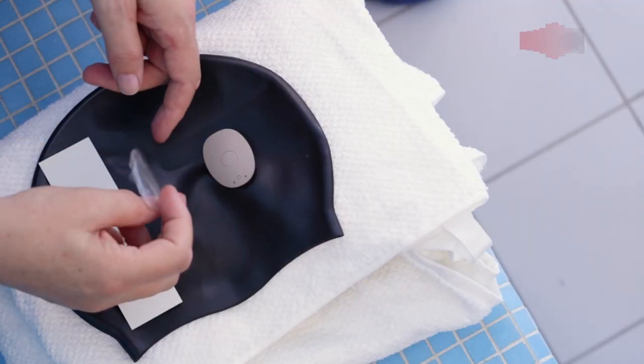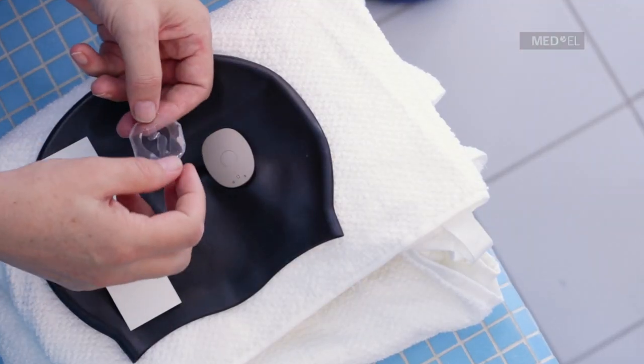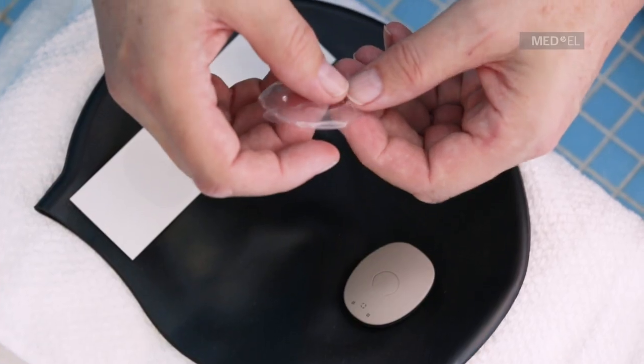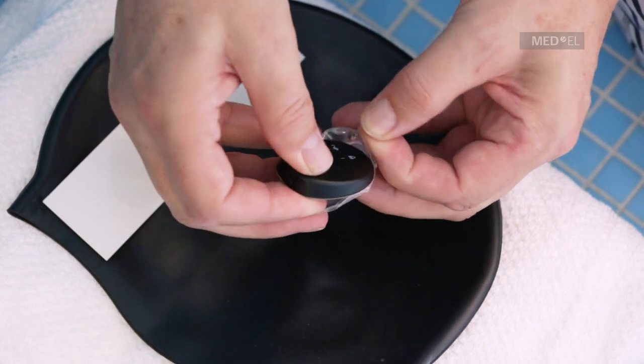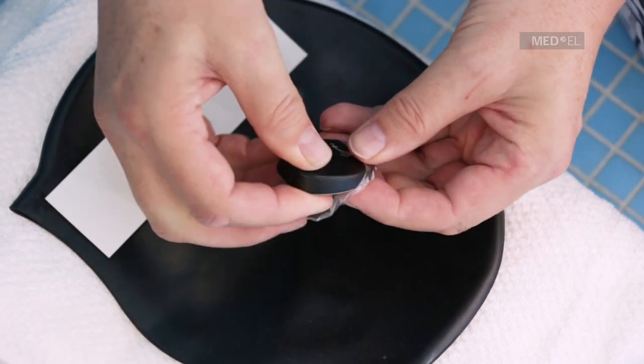Check that both your hands and the waterware cover are clean and dry. Hold RONDO 2 with the MED-EL logo facing upwards. Insert it microphone first into the cover.